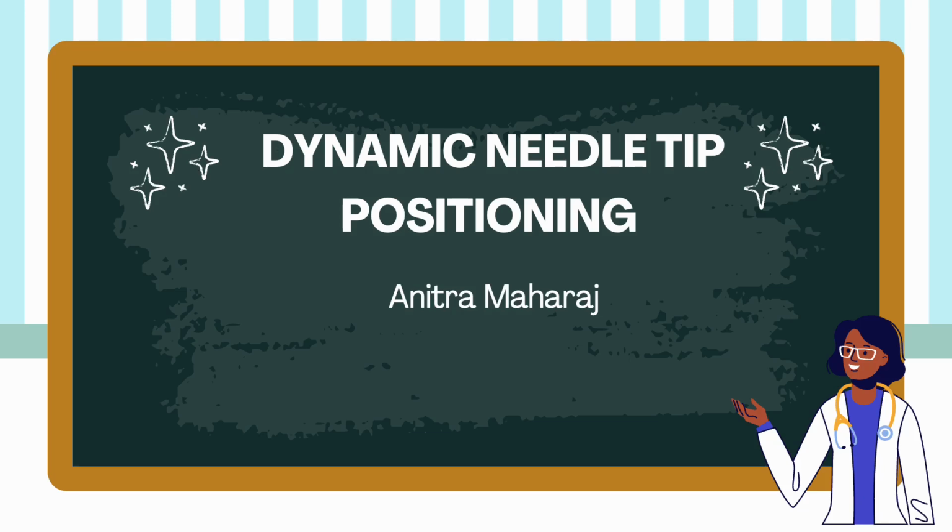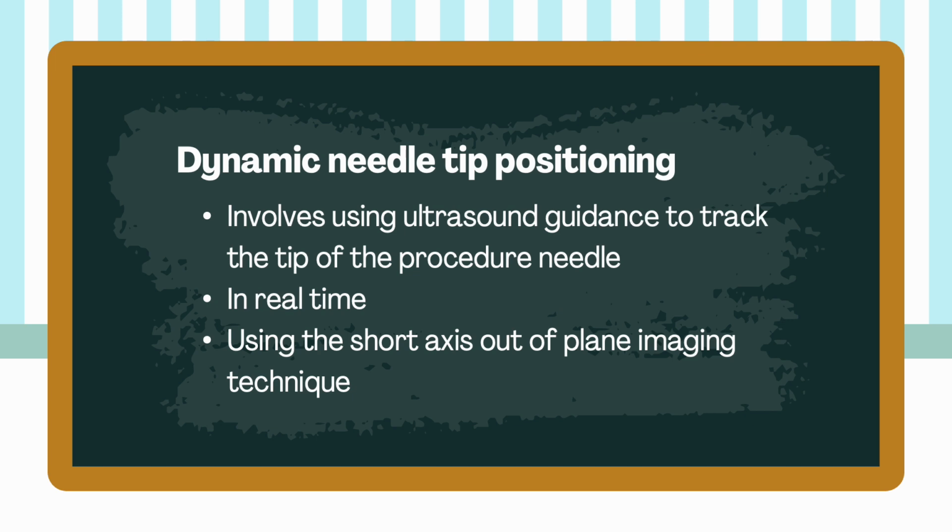Today I will be exploring the concept of dynamic needle tip positioning. Dynamic needle tip positioning involves using ultrasound guidance to track the tip of the procedure needle in real time using the short axis out-of-plane technique.